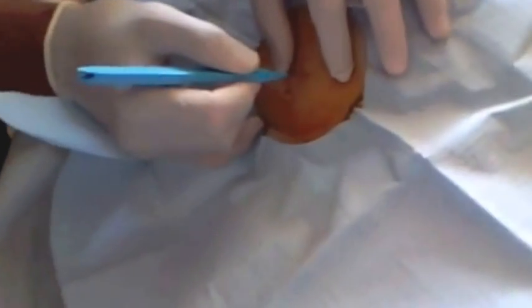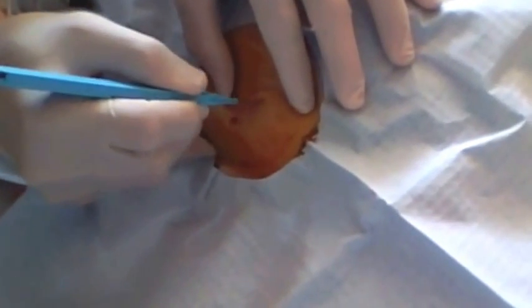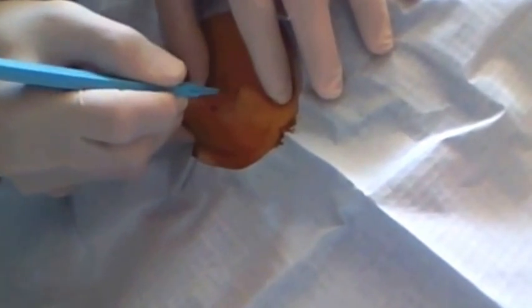Once the area is anesthetized, you need to cut a little incision there to be able to put the catheter through. You just want to make it right through the skin itself. You don't want to go too deep with this.